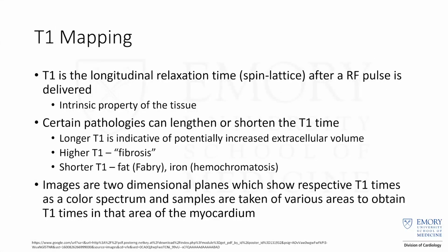We also then do T1 mapping. T1 is basically the longitudinal relaxation time. It's also called spin-lattice relaxation after a radio frequency pulse is delivered to the heart. It's the relaxation time basically after that pulse has been delivered, as the heart reorients in the magnet.